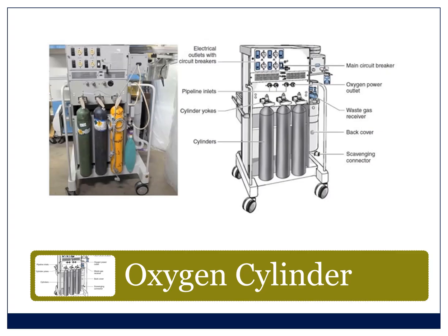Check this every time. Check the oxygen cylinder at the back of the machine. These things are usually turned off because otherwise they slowly leak and empty. So you have to go around the back of the machine. You have to open the oxygen cylinder. Then you come around the front of the machine and look for the pressure in the cylinder, which will read on the screen somewhere on the anesthetic machine. A full one is about 137, but it must be at least 50. And once you've checked that, then you go around the back again and you close it so that it doesn't leak out. And I generally just do that at the beginning of the day.